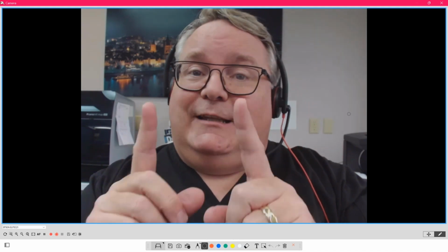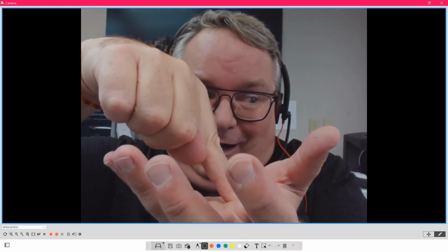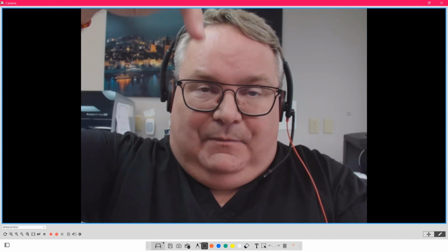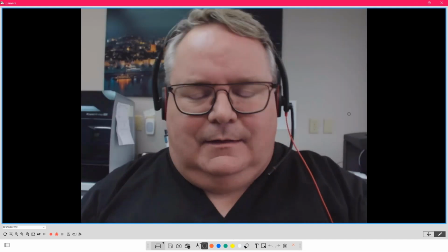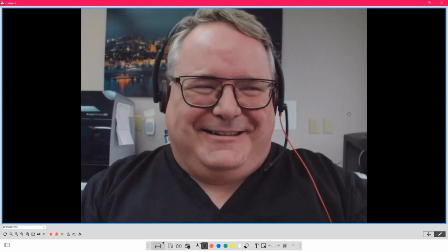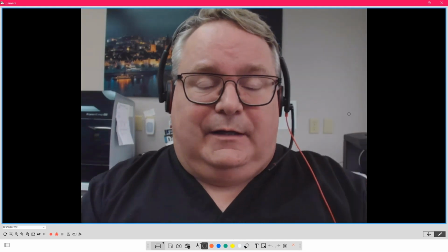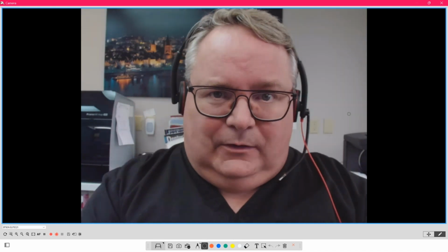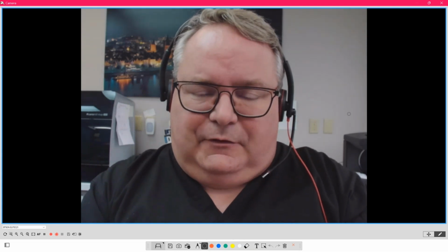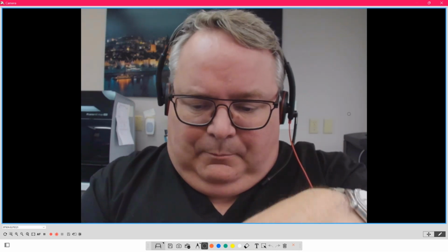Yes and no. Yes, in terms of the red dot into the black dot. Thank you for that awesome question, my dear colleague. I had to hit the reset button. Physiodens is similar. It is a freedom in centric tooth. So again, you have that little bit of wiggle within centric. The main lingual cusp is going to sit into the fossa of the antagonist of the lower. So it's like a mortar and pestle. So again, you'll have that red dot going into the black dot of the bottom bowl.